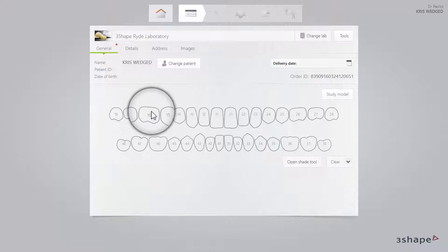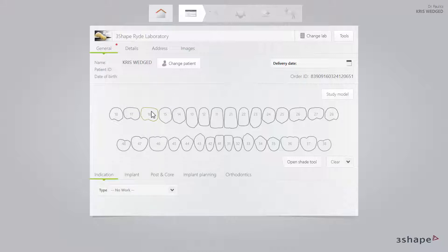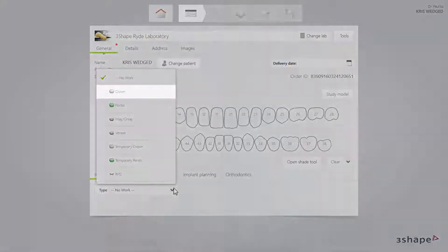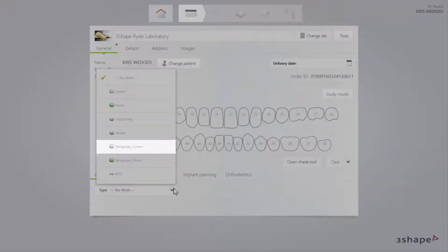Mark the tooth that needs to be restored. The tooth will be outlined in green. The Indication tab will open at the bottom of the window. We are planning to make a single crown. Click on the Type drop-down list to select a crown. You can select either crown or temporary crown, depending on your needs.